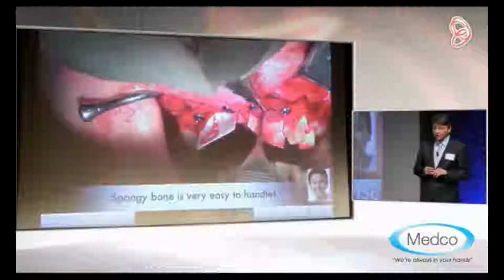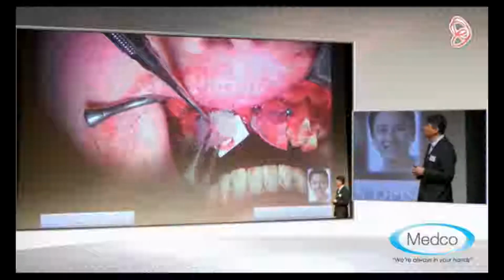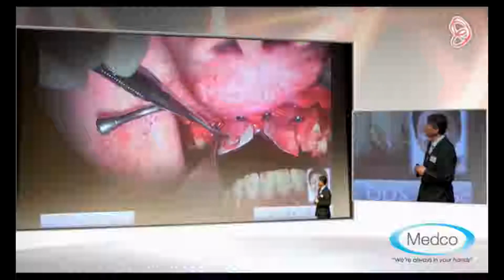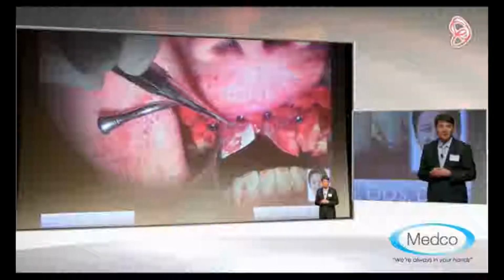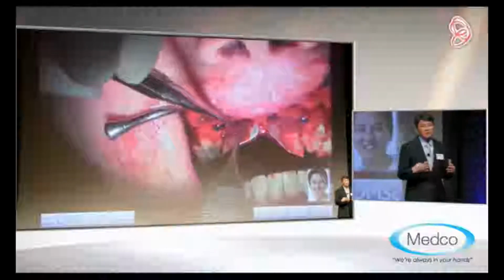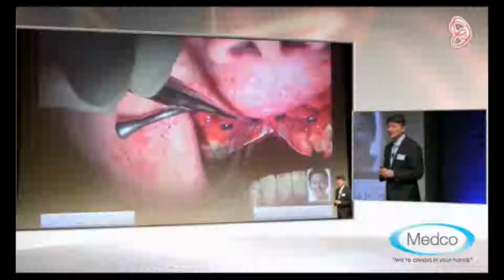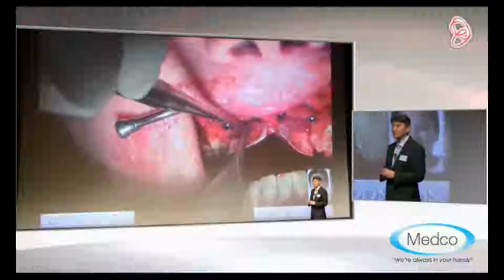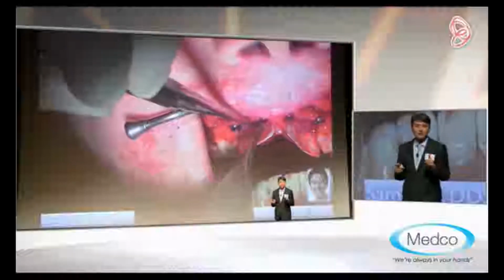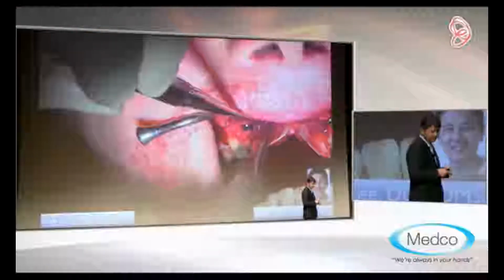So as you can see, all you have to do is really eliminate the wrinkles in the bone block. And because it's malleable, as you can see, I'm able to put it in very, very easily. And because the palatal flap is very thick and rigid, there is no reason to use titanium reinforced membrane, and there is no reason to use non-resorbable membrane.